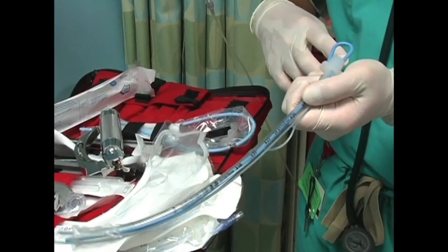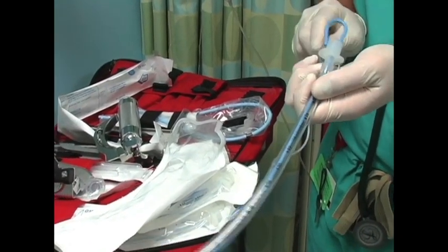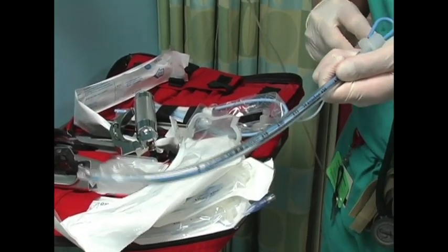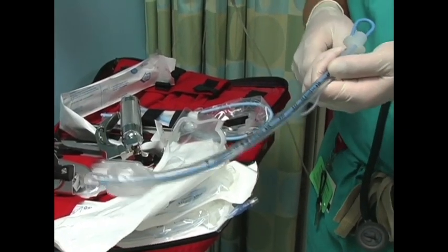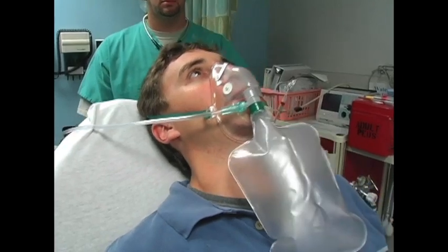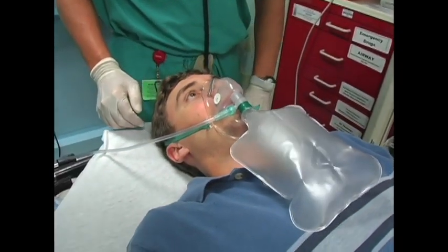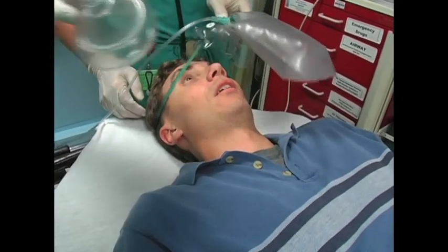Now we shall see these steps in action. Here we see preparation of the equipment while the patient is being pre-oxygenated. In real time, the pre-oxygenation begins approximately 5 minutes prior to the actual intubation. In anticipation of drug administration, the patient's head is lowered and preparation is made for bag valve mask ventilation.